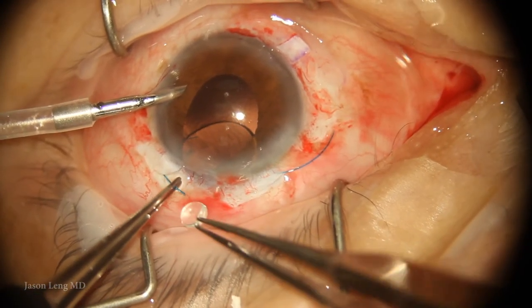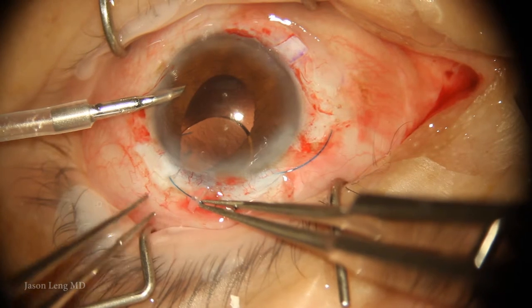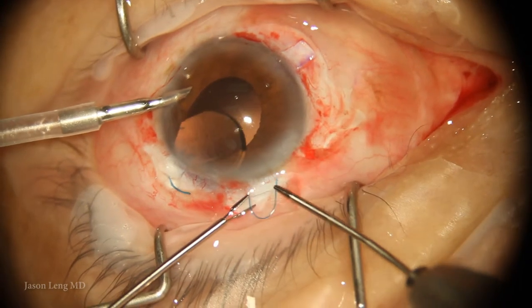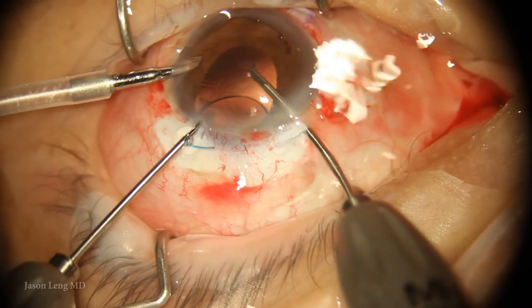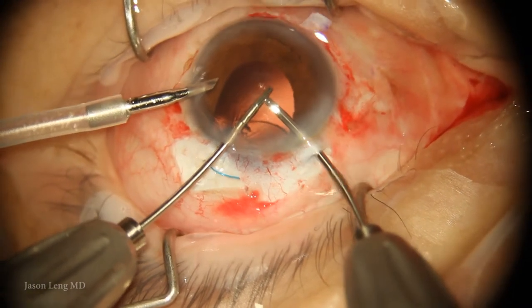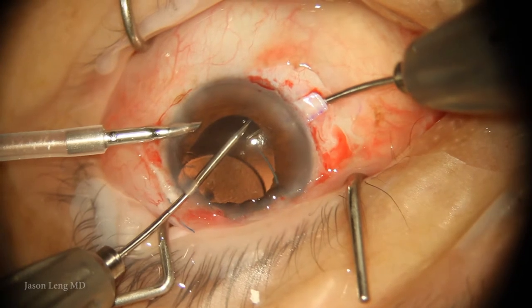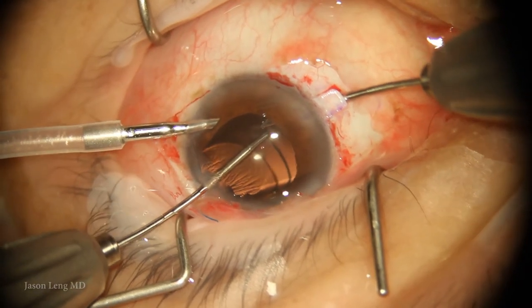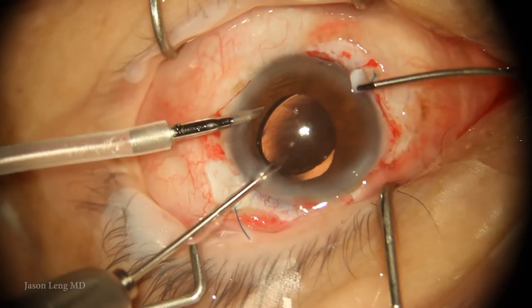Because I don't have an assistant, I put a small donut — taken off the capsule hooks — which gives just enough security to hold the haptic and prevent it from falling back into the eye. With that secure, I insert the trailing haptic through the tunnel using a handshake technique as described by Dr. Agarwal. Looking back, I should have grabbed the very tip of the haptic with my right hand pushing into the eye, because I had to grab it twice passing from left to right hand. Also, the tip of the haptic got slightly bent during externalization — something to keep in mind.